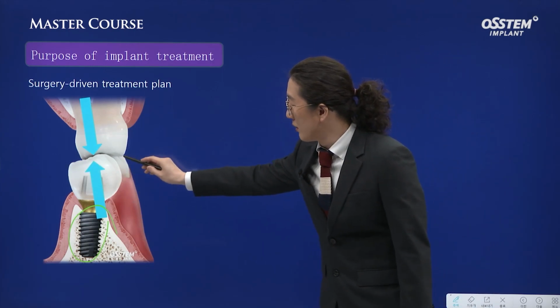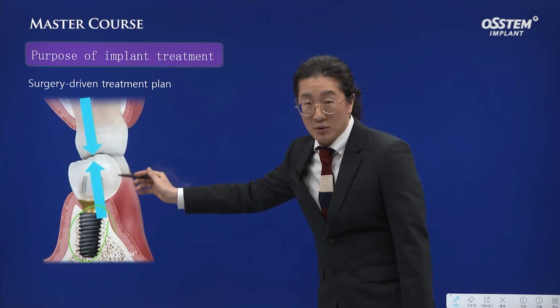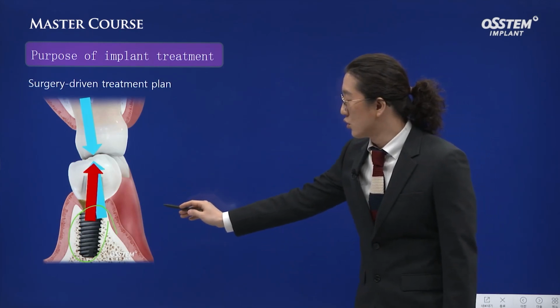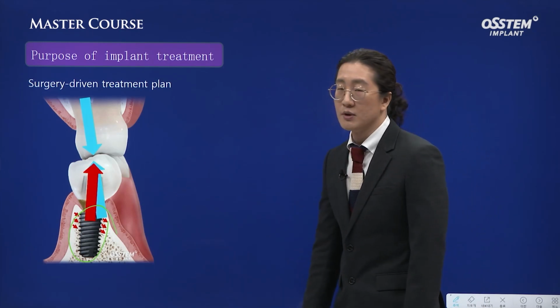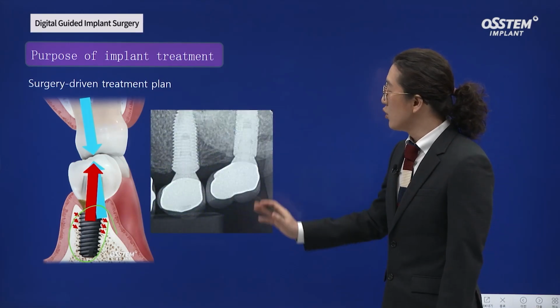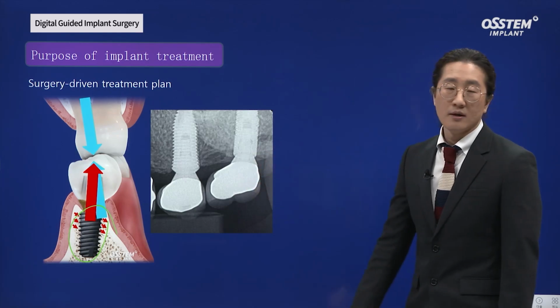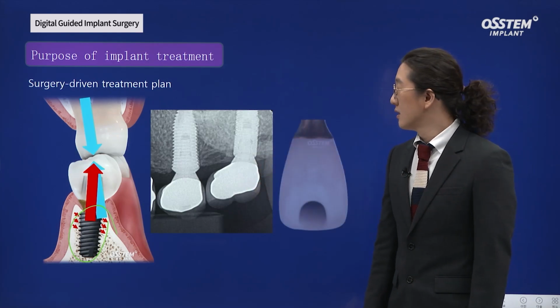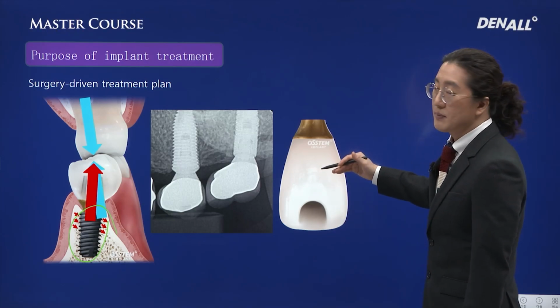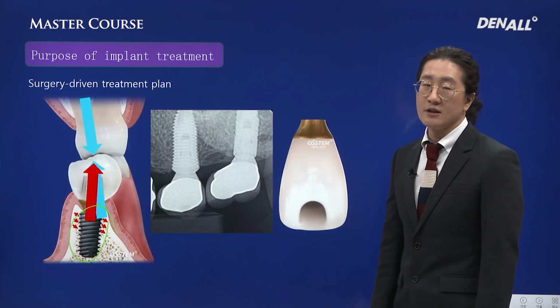The downside of a surgery-driven implant placement is that although the crown position should be like this considering interarch relations, because implant is placed where the bone is, the implant inevitably experiences more lateral force. This is a typical issue that can occur due to surgery-driven approach. Due to slightest difference, the implant can be inclined distally and you can end up with cantilever type of prosthesis, or in the case of upper anterior case, you may not be able to provide SCRP type prosthesis.